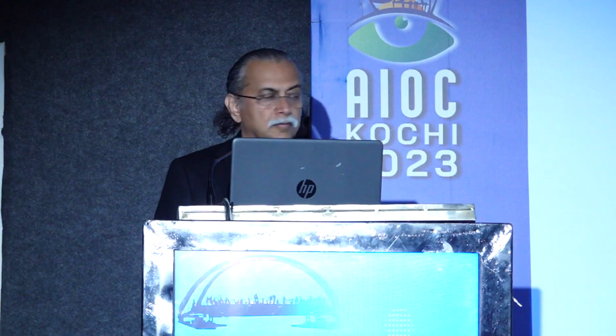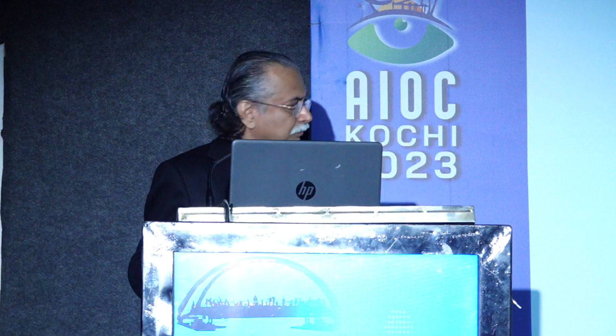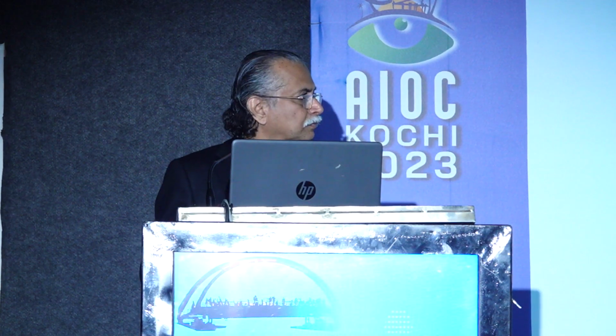Next, while it gets set up, it's definitely a fantastic innovation by Zeiss.